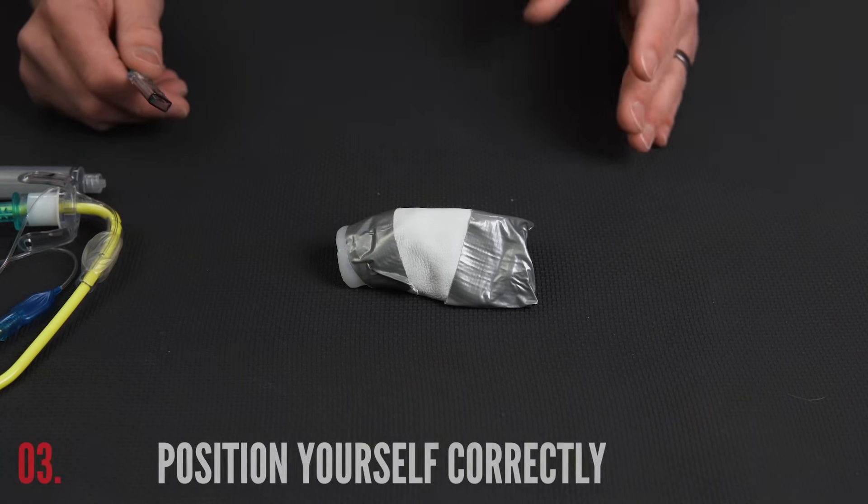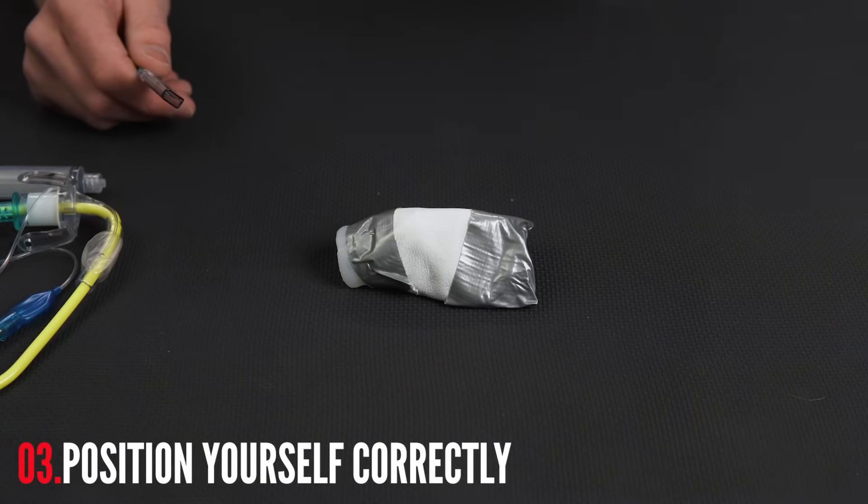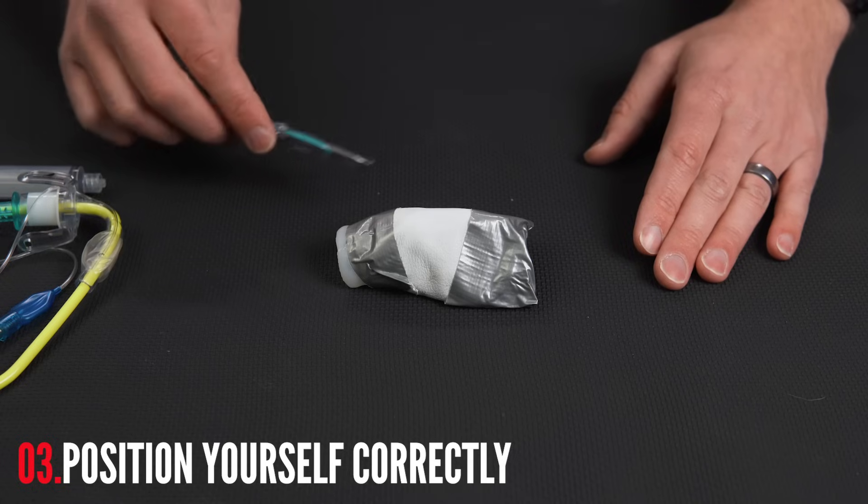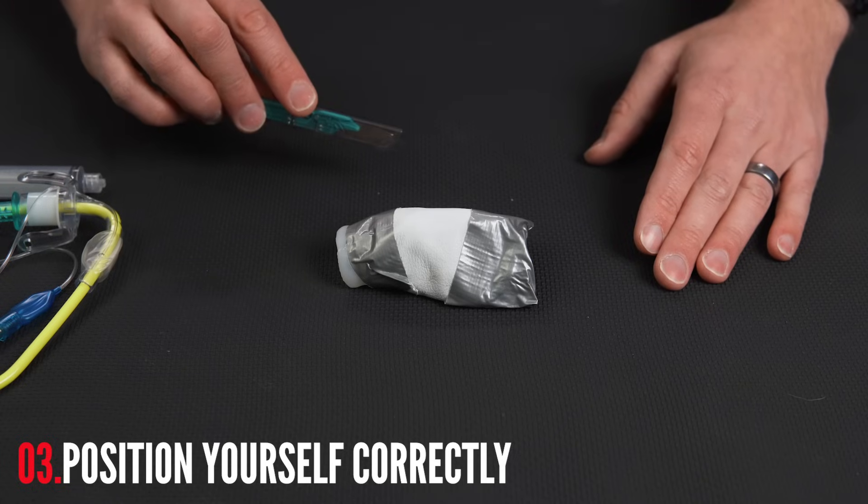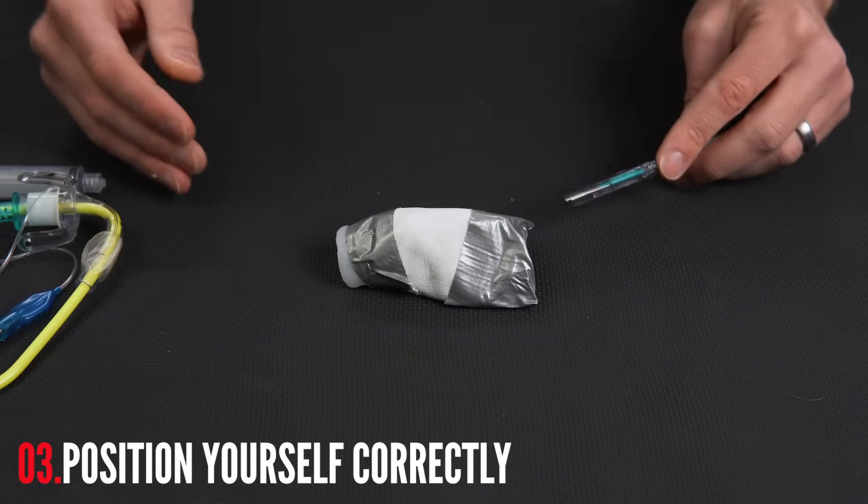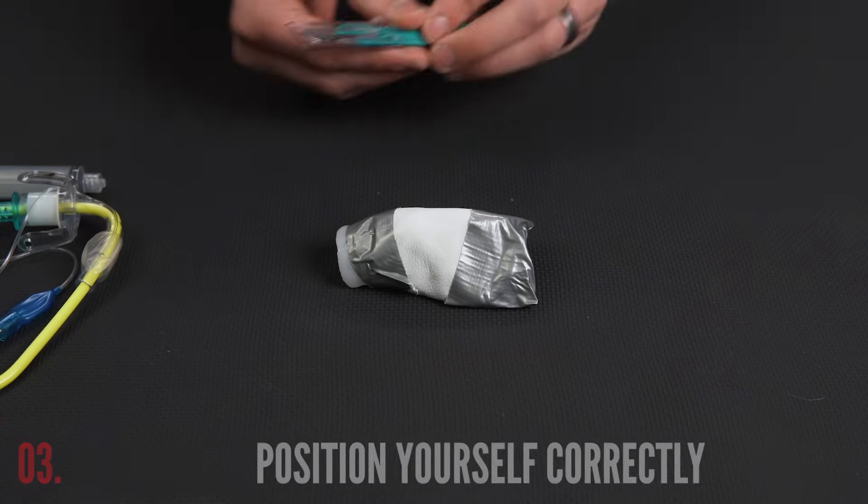When we position ourselves next to the patient, we make sure we are on whatever side is dominant. We need to be on that side of the patient. So if I'm right-handed, I need to make sure I'm able to hold the scalpel in the right hand and I'm going to position myself on the right side of the patient. If I'm left-handed, same thing.